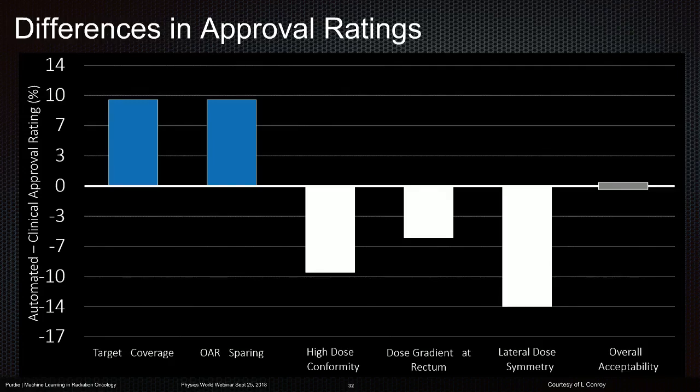What was interesting is that we had the same number of acceptable plans. In fact, one of the automated plans generated was deemed unacceptable by 2 reviewers, and two clinical plans were deemed unacceptable by one reviewer each. So they had the same total number of reviews as being unacceptable.